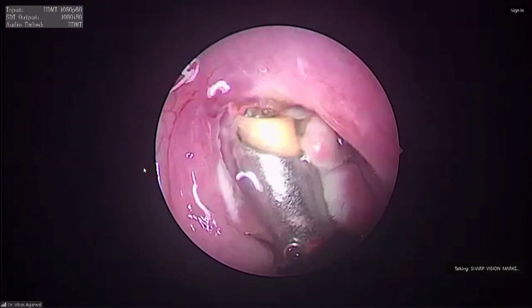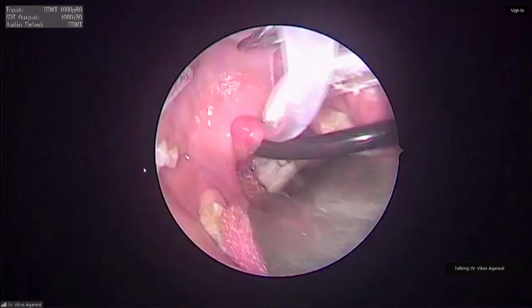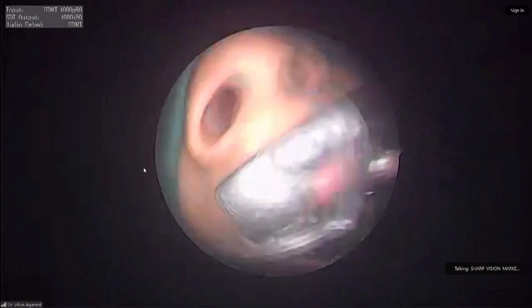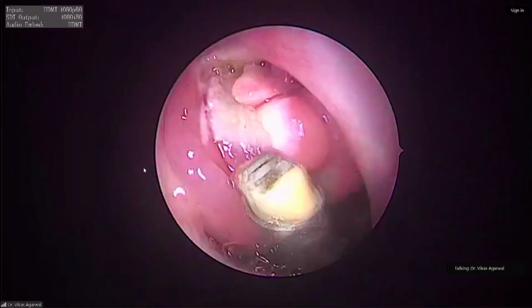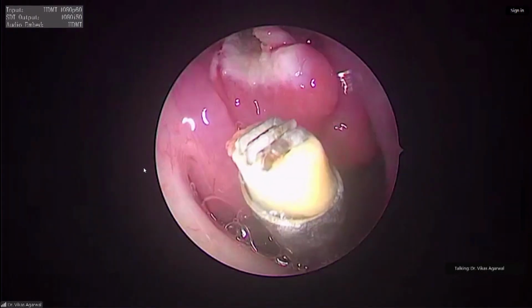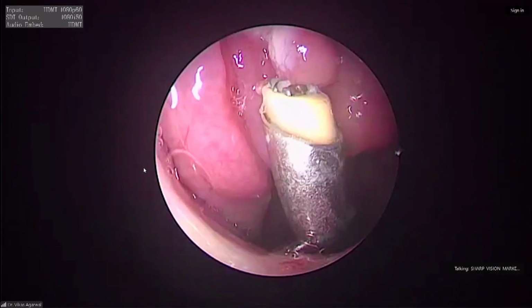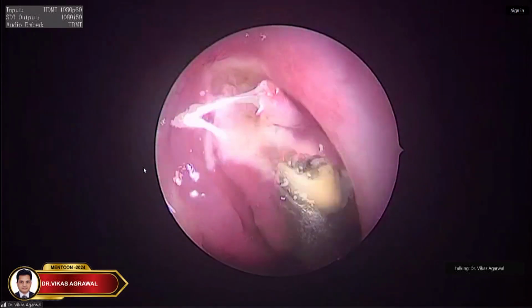Can you please show the retraction externally, non-endoscopic? How the palate is retracted? Can you see that? Yes, we can. Why this retraction is important, can you see, this is the insulated part of the wand. This is the passive electrode. If this is touching here, then you may get a burn on the soft palate. That's why we retract it. Otherwise, there is no need to retract.